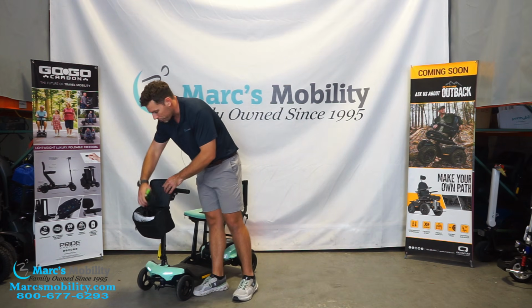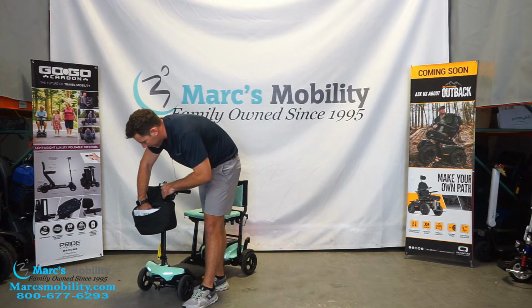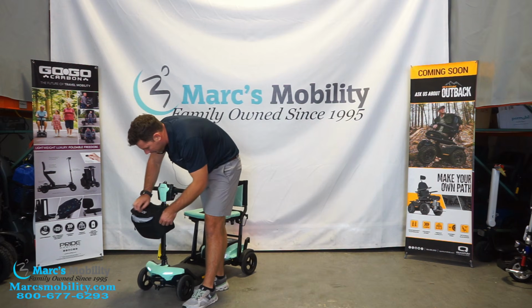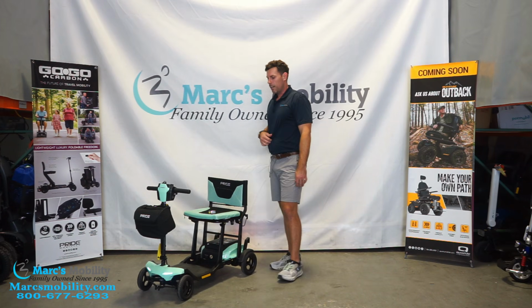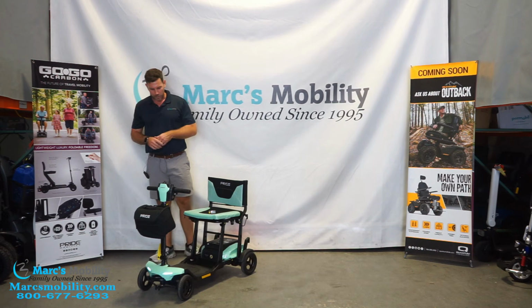It is a lithium charger, so it is going to charge at the full amount of amperage all the way throughout. I think these are going to come with a 3.5 amp charger right now. So we'll just say it's a 12 amp battery. So you're looking at about 4 hours, give or take, of charge time to fully charge this battery. So it's not going to take that long to fully charge.